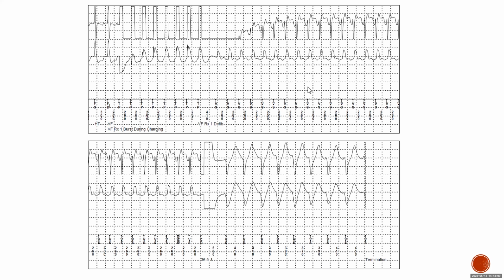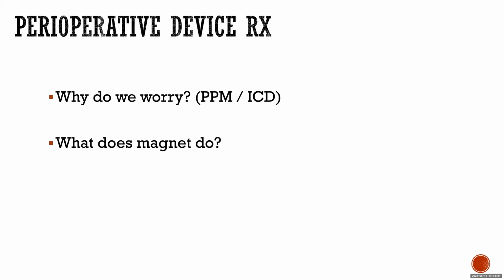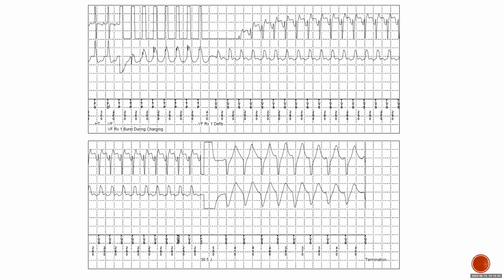Now you manage the patient as VT. You discuss amiodarone, calcium, electrolytes, ablation, and so on. So, good. This is essentially what I think you need to know about ICD interrogation. As I said, this is really EP level, but when you admit the patient, you need to know that this is what needs to happen. The big picture: is it appropriate or not? How do we know in general terms? And then you manage the patient.